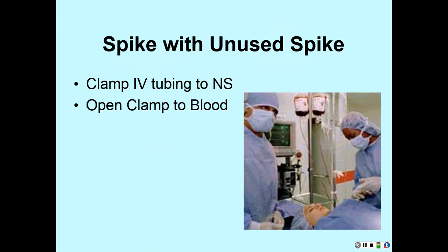These are just what we've basically talked about. You can infuse too, but I'm not going into that today. We'll let you get a little used to the concept first. But if you only open the one at the top that you want to infuse or prime, you're okay. That'll keep you from having them mix.